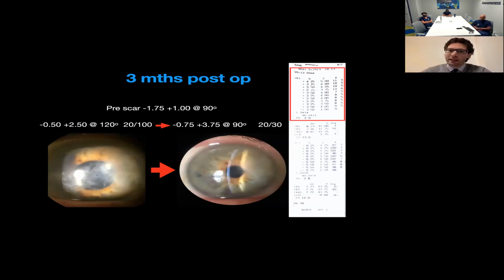And with a Weck-Cel, I try to dry it up a little bit, just from the corner, to draw some of the liquid, just until I see that some of the peaks are appearing over this liquid. At that moment, I start ablating again. I usually do it only once. I put the masking agent only once, because if you put it many times, you can actually induce more irregularities and more aberrations in the cornea. So I do it only once, and then I go until the end.